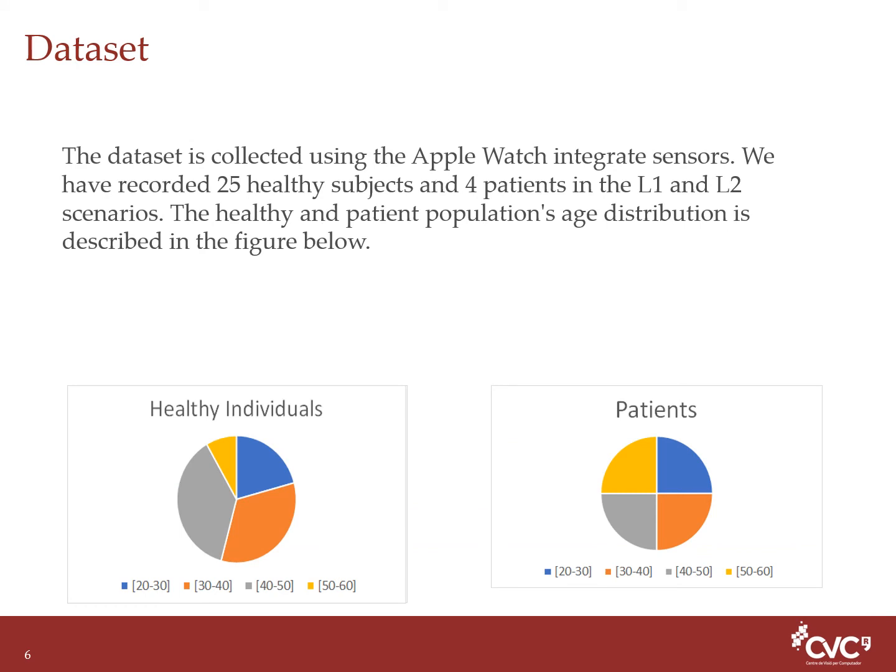Since there exists no public similar dataset for stroke patients, we had to create our own dataset. We recorded 25 healthy subjects and 4 patients. We succeeded to have a patient from each different age category.